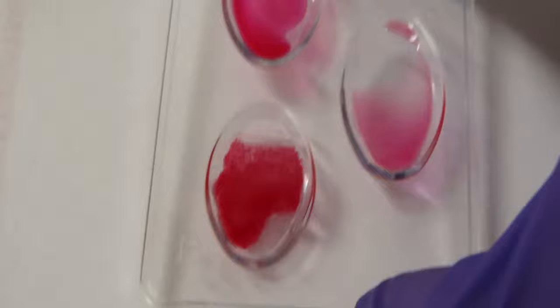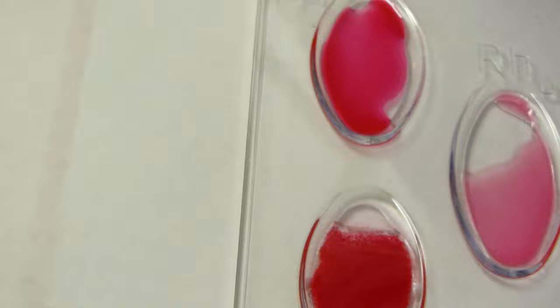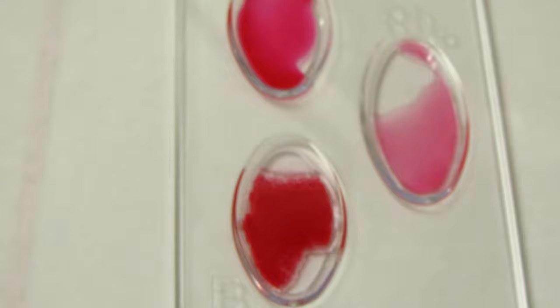Sample number four: there's no clumping in the A well — it's all nice and smooth. But look at all that clumping in the B well — that's agglutination. So this is a type B sample, and there's nothing going on in the RH, so this one is B negative.